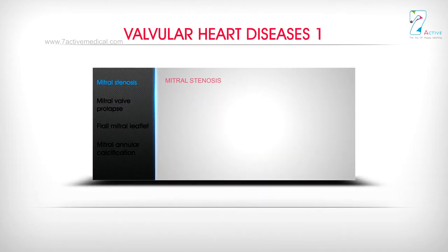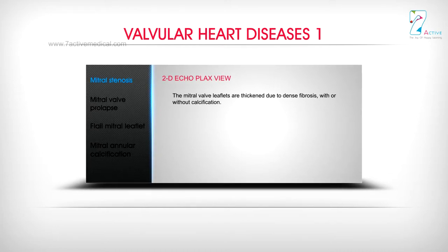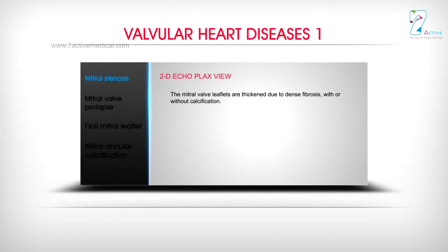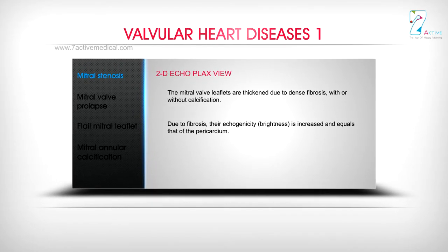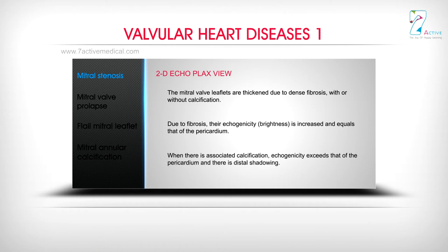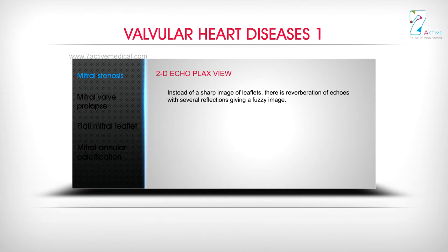Mitral Stenosis — 2D ECHO PLAX View. The mitral valve leaflets are thickened due to dense fibrosis with or without calcification. Due to fibrosis, their echogenicity (brightness) is increased and equals that of the pericardium. When there is associated calcification, echogenicity exceeds that of the pericardium and there is distal shadowing. Instead of a sharp image of leaflets, there is reverberation of echoes with several reflections giving a fuzzy image.